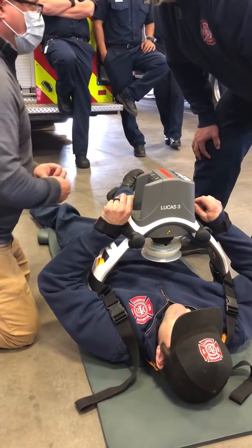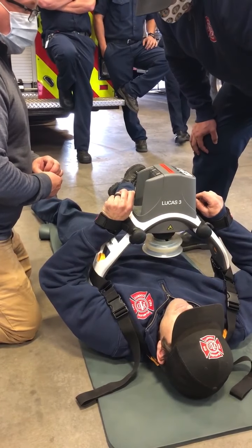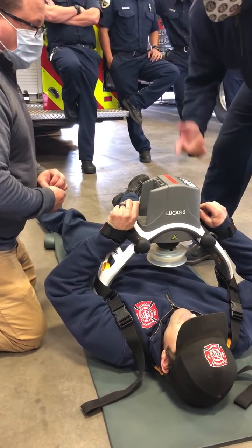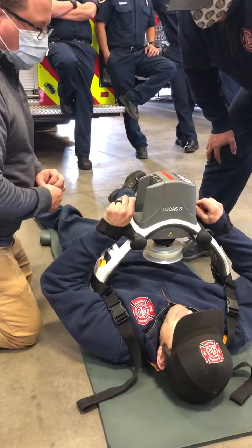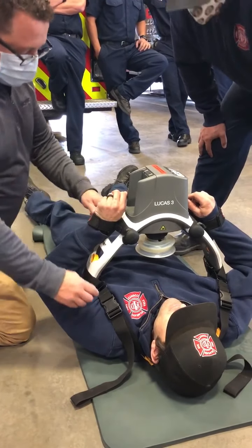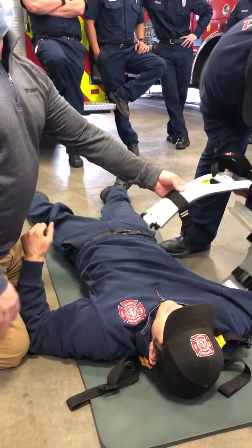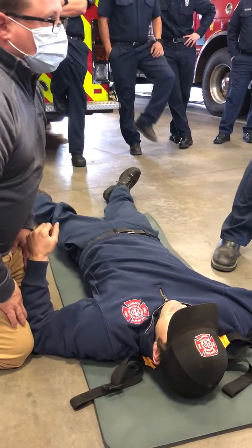Now, something bad happened. Okay. I don't know what it is. The thing alarms, I don't know what to do. What do you do? It alarms, pull the battery. Okay, battery didn't work. Okay, take it off and start CPR. Get it off. So it's 1, 2, 3, and just get it out of your way. Right back on the chest.